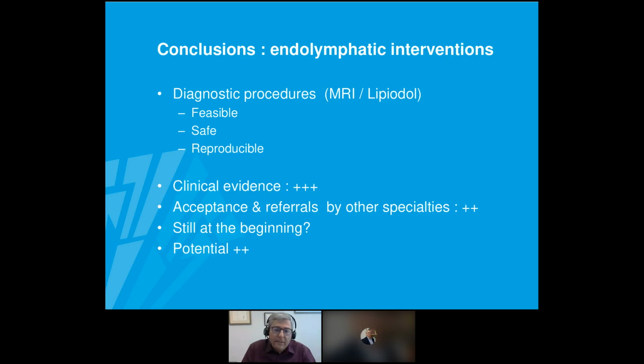Well, you can use a manometer. I think the Philadelphia group likes using an inflation device, the same device you use for inflating an angioplasty balloon, and then you can very slowly inject your Lipiodol through that system. I typically do it with a syringe, but I use a connection in between the spinal needle and my syringe.